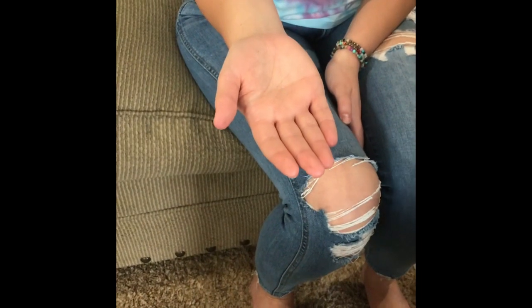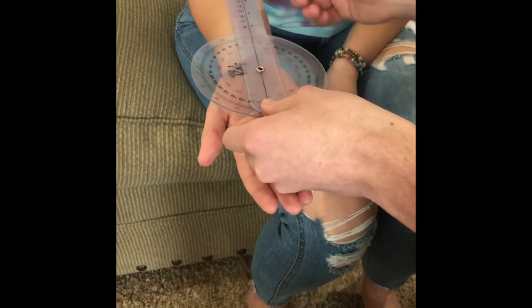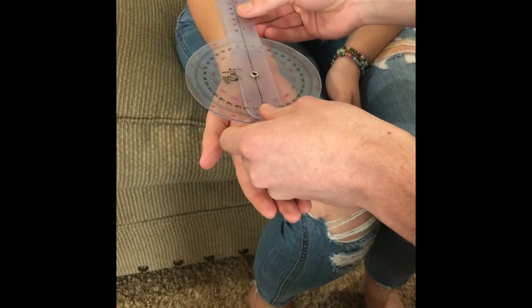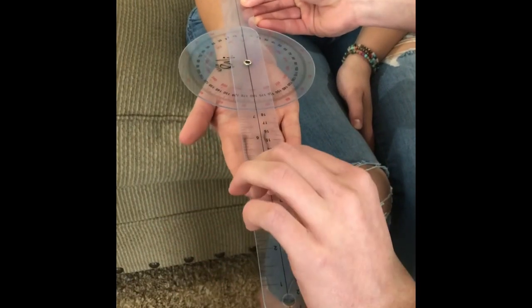All right, now we're going to be measuring ulnar and radial deviation of the wrist. In order to do this, you need to place your axis of rotation right here at the base of the wrist. Your stationary arm is going to be the ulnar side of the forearm, and then you're going to have the movement arm equal with your middle finger right there.